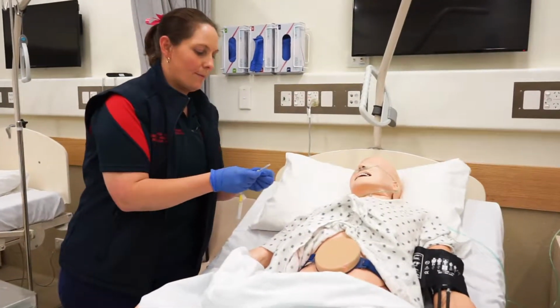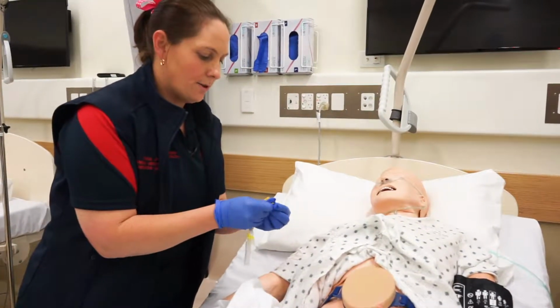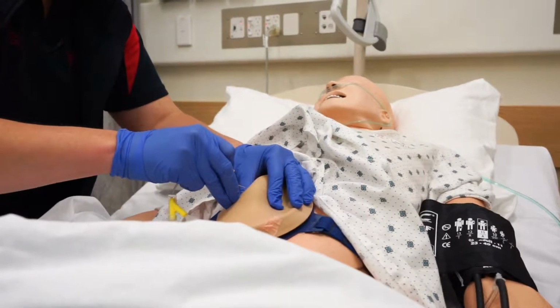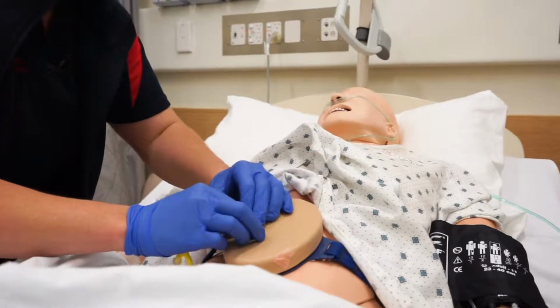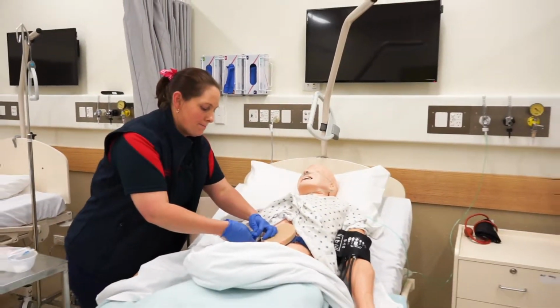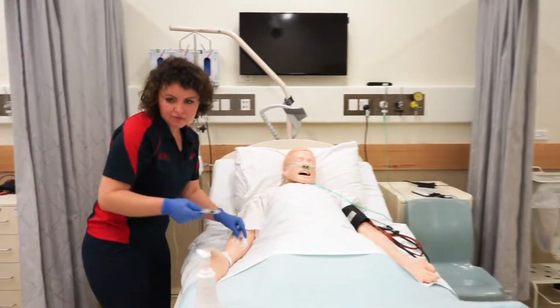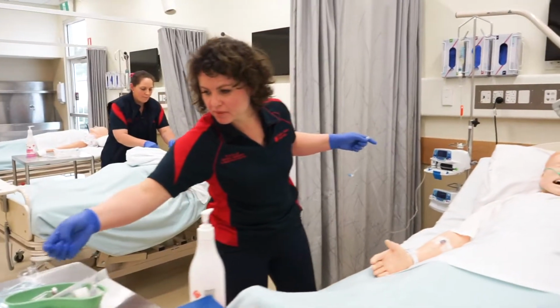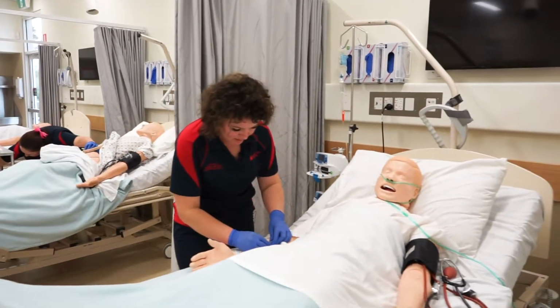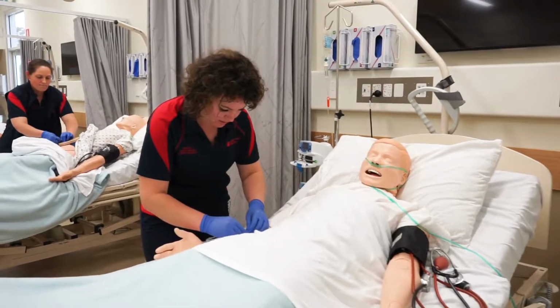So this is the subcutaneous needle, and so it just gets inserted into the patient's abdomen. All right, little sharper now, in we go. So straight into subcutaneous fat there. So how's the antibiotic prep? I've just flushed the line and I've primed and prepped the IV antibiotics for the patient. I've got consent off Seth and I've done the 6 medication rights.